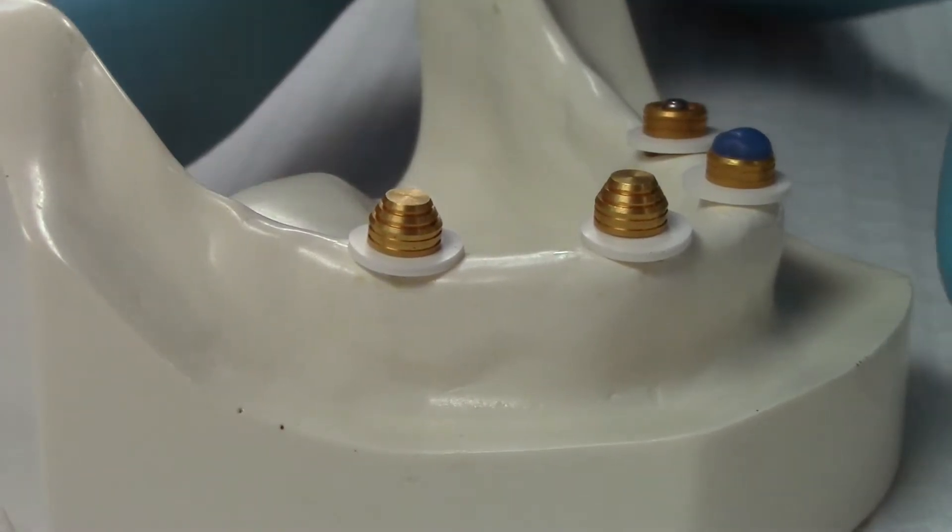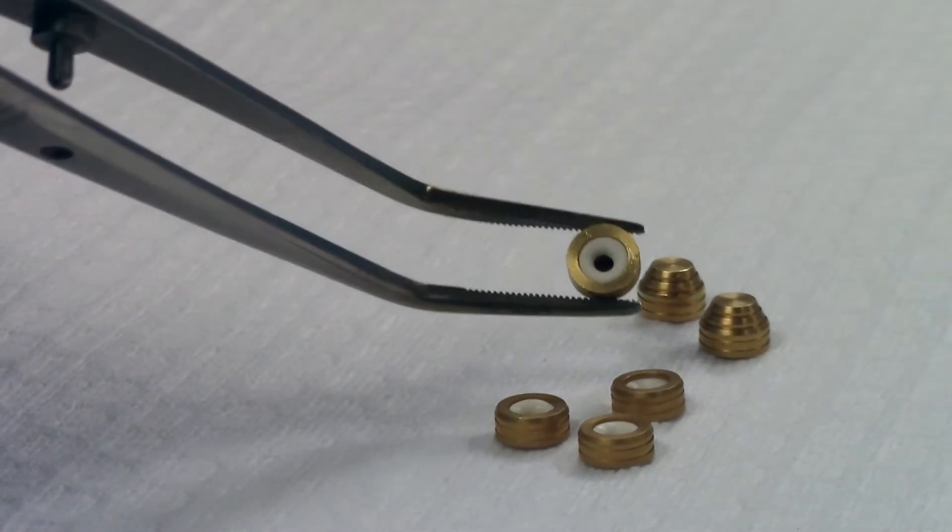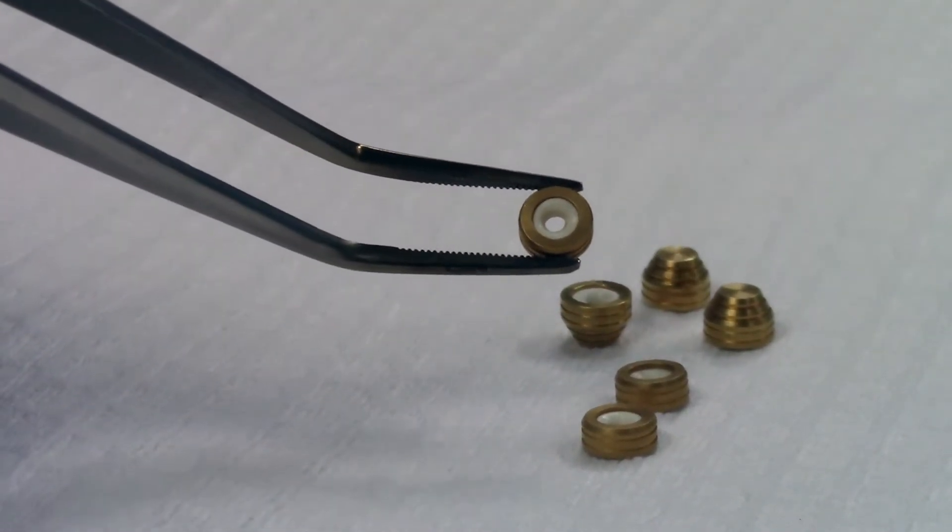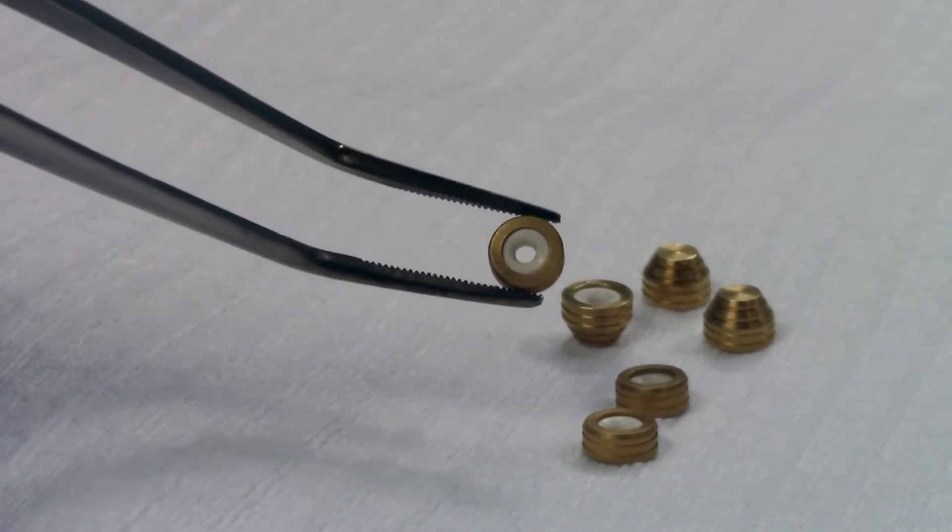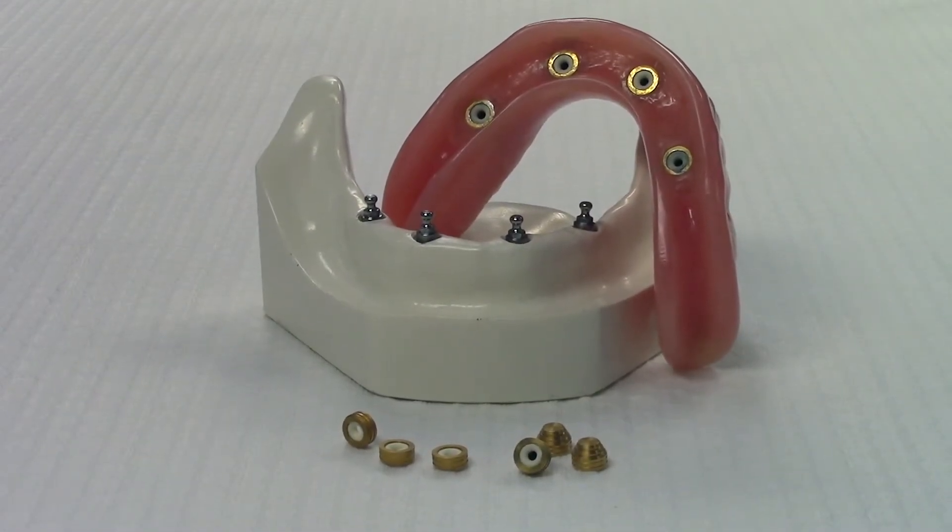The retention cap does this block out for you. That's why the retention cap is much more popular. The vertical space requirement is the same as the ring, but there is no block out material that you have to remove through the ring after processing.